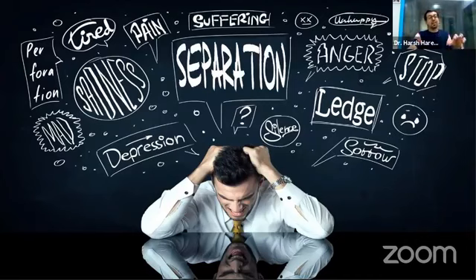The primary solution to take care of this problem is providing a good glide path. If you have a good glide path from the beginning of the procedure, you will definitely not have too many endodontic complications during the procedure.